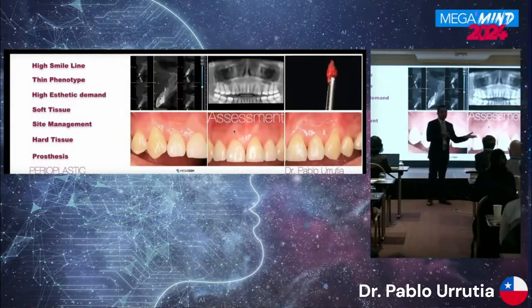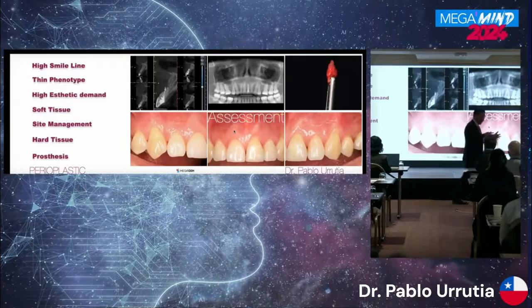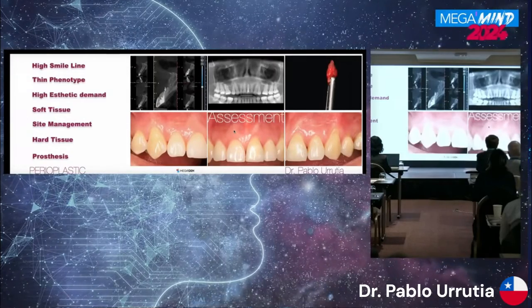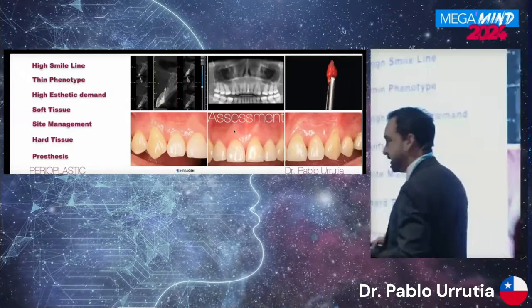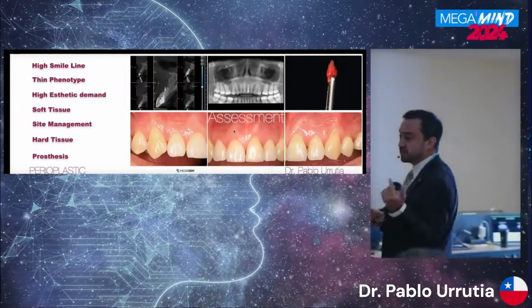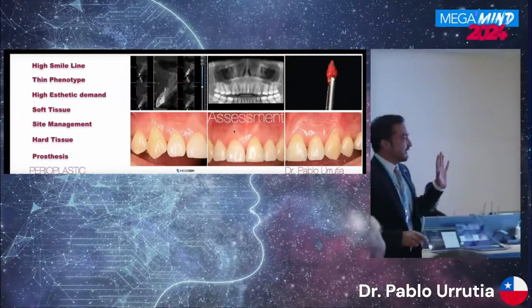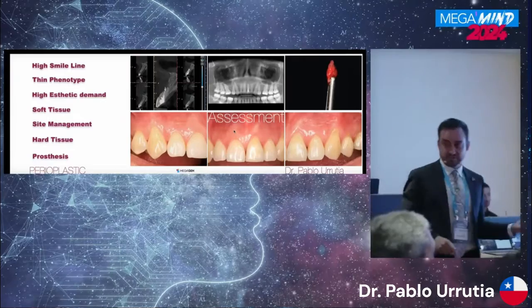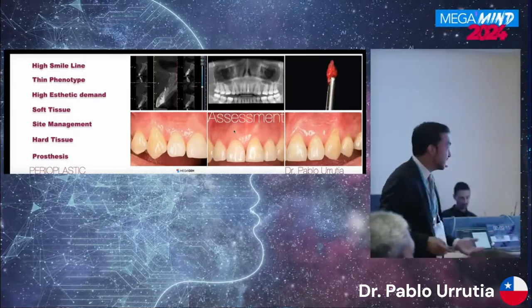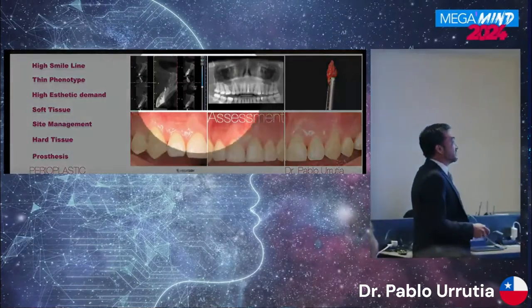But what happened with early implant placement? You have to wait 8 months, 8 weeks, sorry, and the healing of soft tissue, what happened with scar tissue, what happened with recession, with aesthetic, and the timeline and comorbidity of the patient. So for us, why don't we think differently about this kind of approach? What happened with recession too, and the aesthetic, okay? So this is the situation.